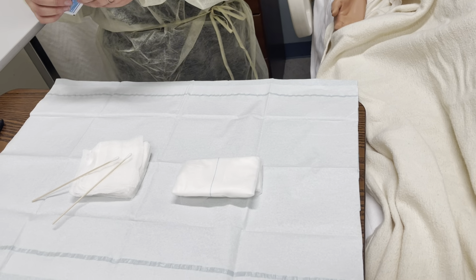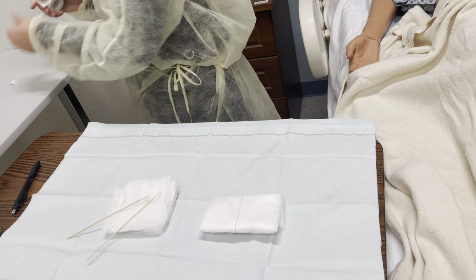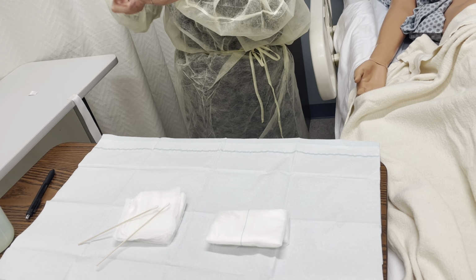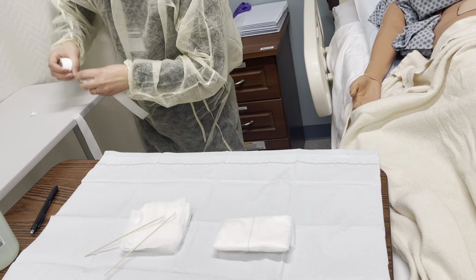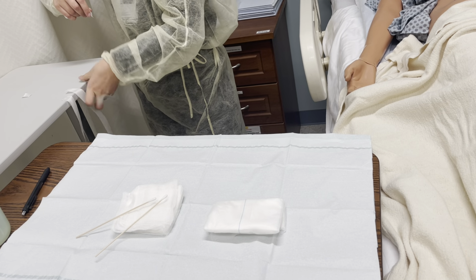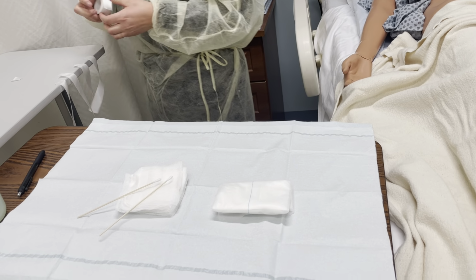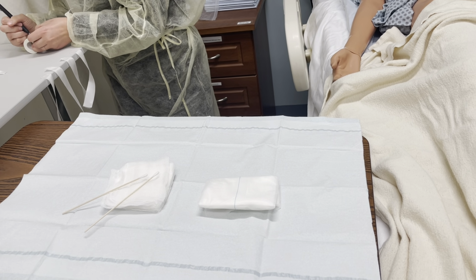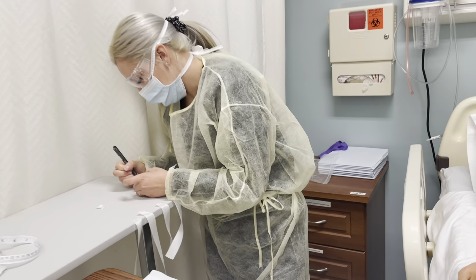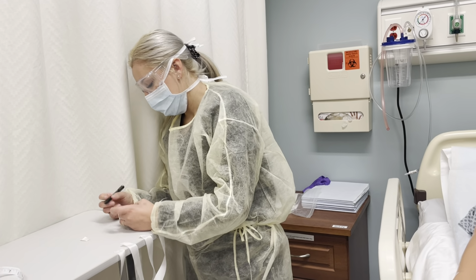Okay, and then opening up my ointment. And then preparing 5 pieces of tape, making sure they are long enough to cover the sides. 1, 2, 3, 4. And then writing the date, time, and my initials. So it is 01/26/23. It is currently 11:50, and my initials.